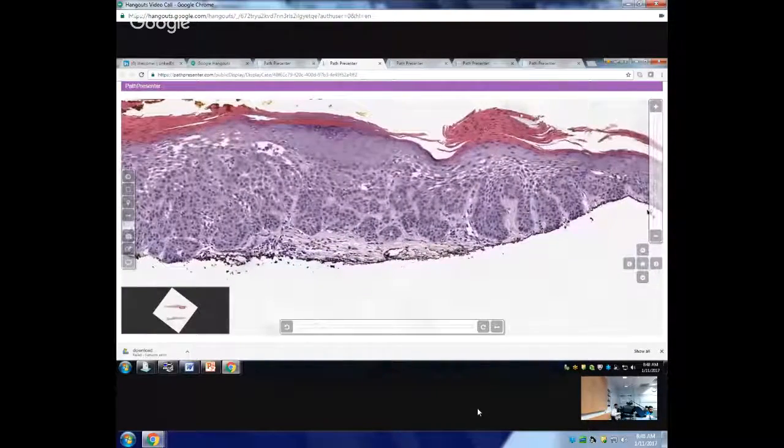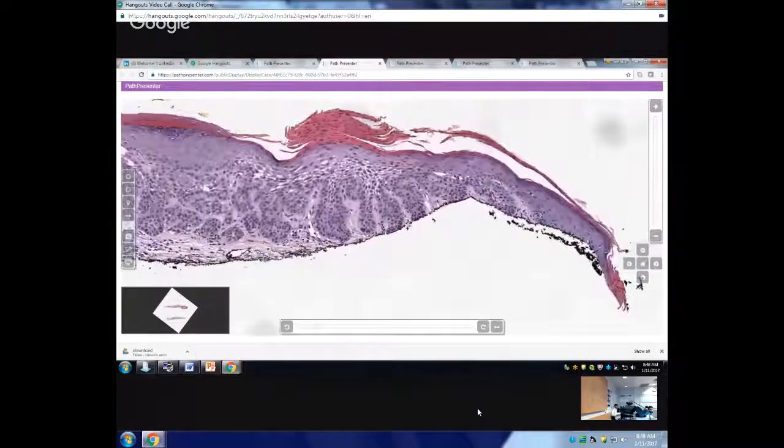See, all this parakeratosis on the top is very characteristic, and squamous cell carcinoma will always show some atypia going at the periphery. Look at the AK going at the periphery, which is not present in the porocarcinoma.